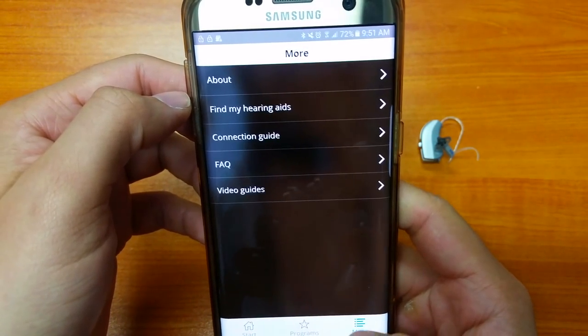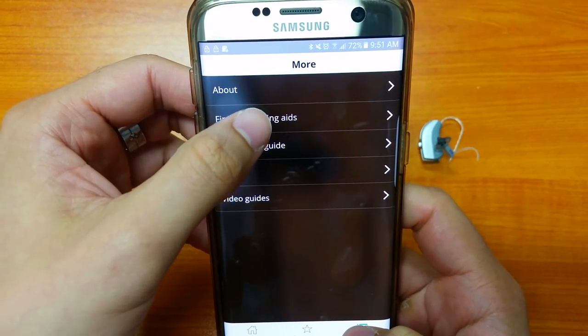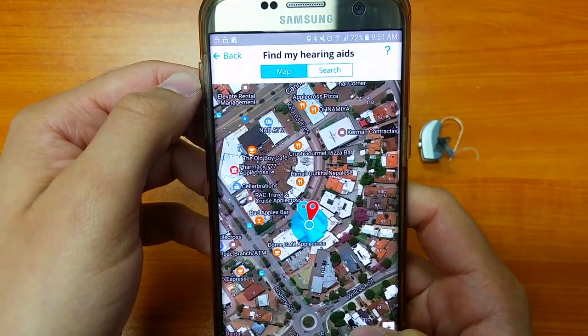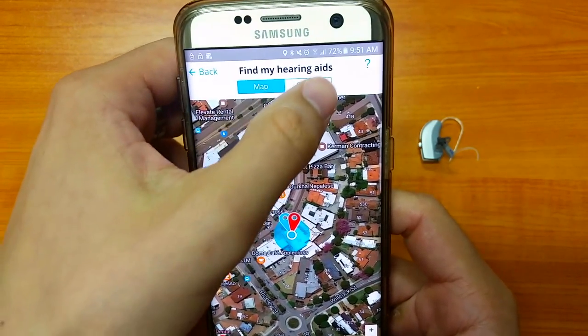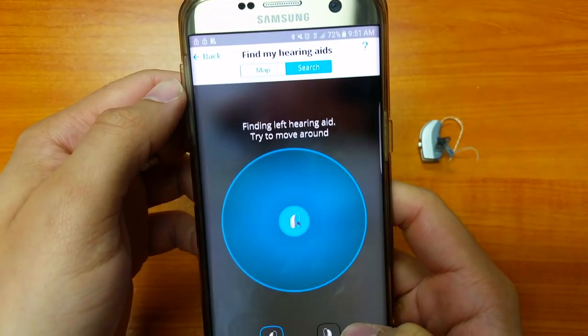Another feature we like is the Find My Hearing Aid section. If you misplace your hearing aids, there is a feature which tells you where they were last seen, and there's also another mode to help you find where they are.